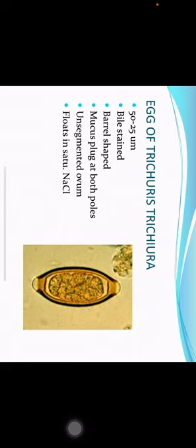Eggs of Trichuris trichiura are 50 by 25 micrometers in dimension. They are bile stained. They are barrel shaped with a mucus plug at both poles. Inside there is an unsegmented ovum.